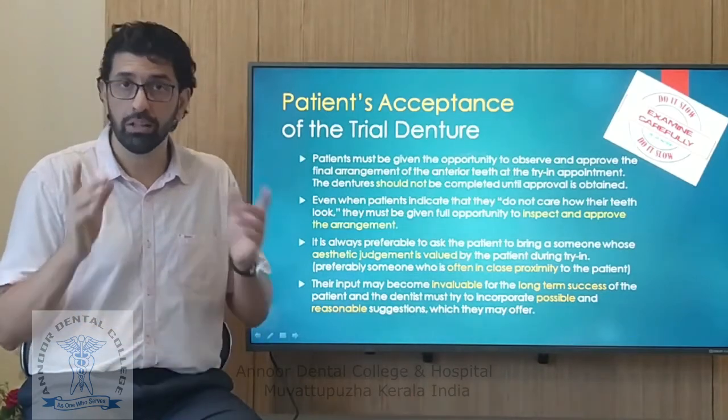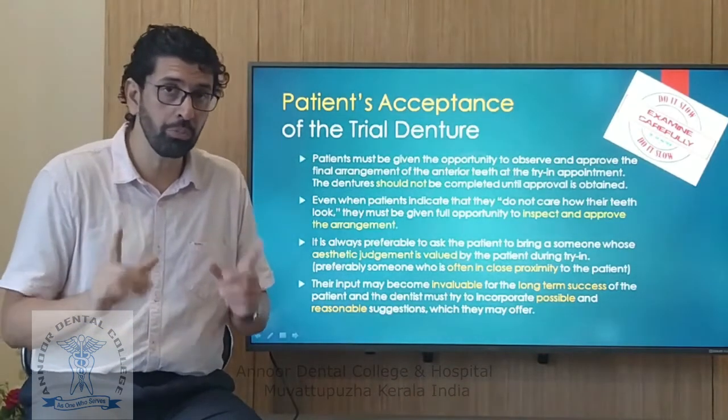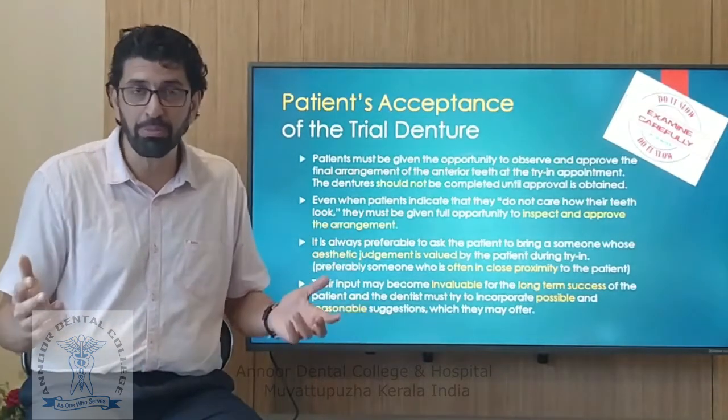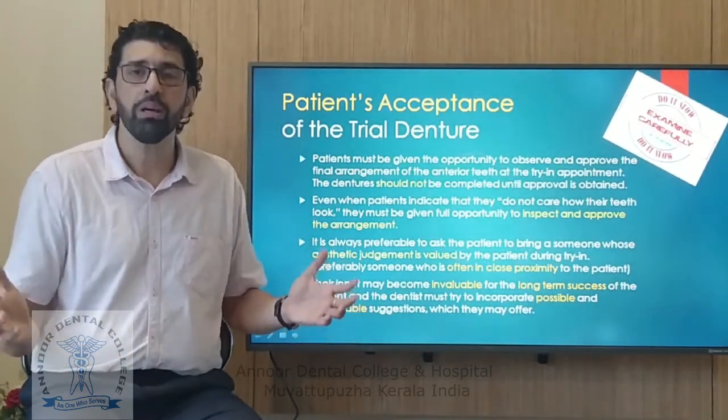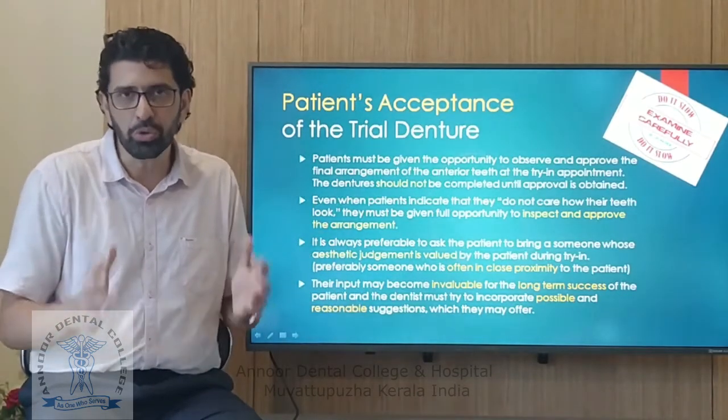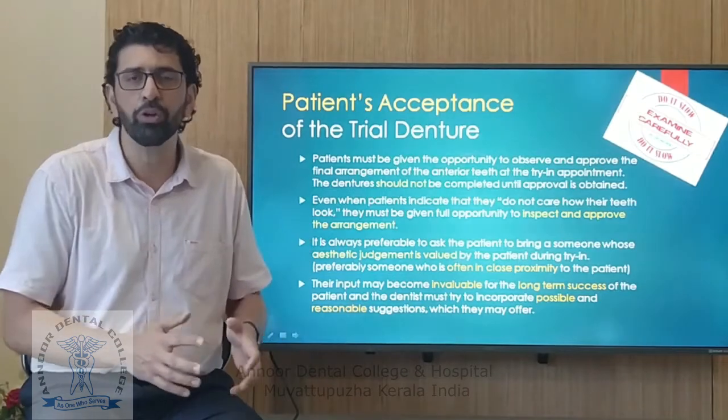All right? And this also will tell you if you had any mistakes in your processing. So if you had a mistake in the processing and there was a problem, then at least you know the problem is genuine. At least you know where the problem happened, and you can always correct it.